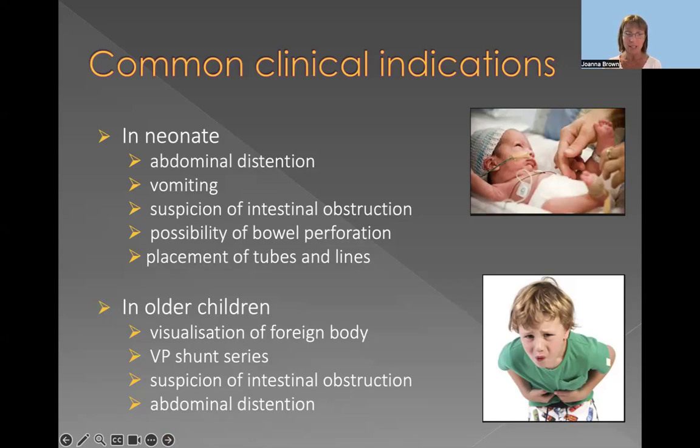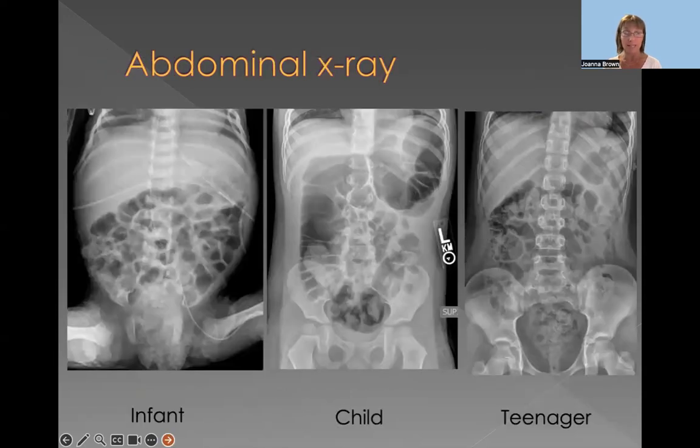If we have an ultrasound available in our department, ultrasound will be the first imaging modality for abdominal pain in children, not the X-ray. However, if the ultrasound is not available, then we can do the X-ray.